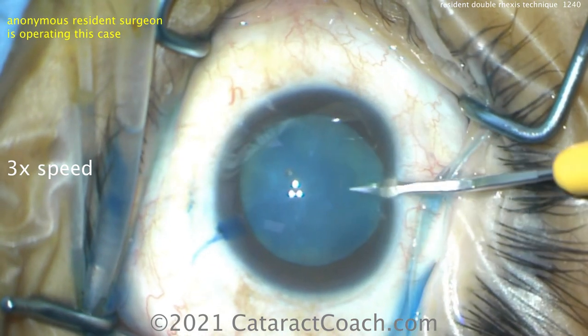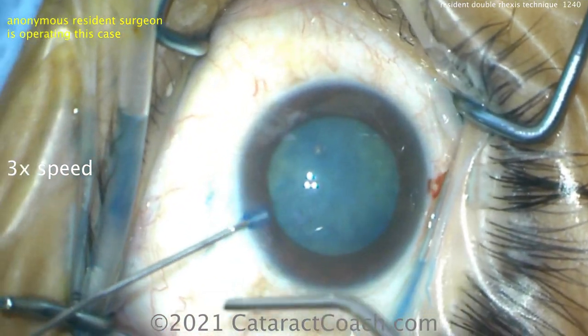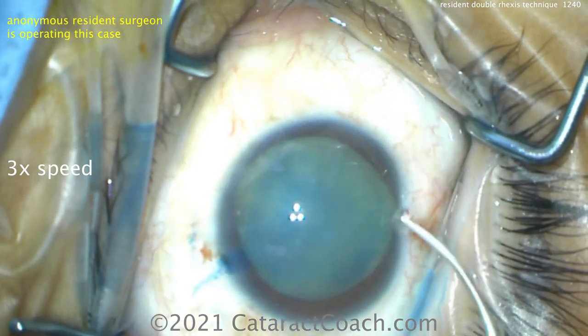Trypan blue dye going in the eye. A second paracentesis to make life easy. Let's get a good fill of the viscoelastic. Here's our dispersive viscoelastic — you want a good fill and you want to get that pressure up.